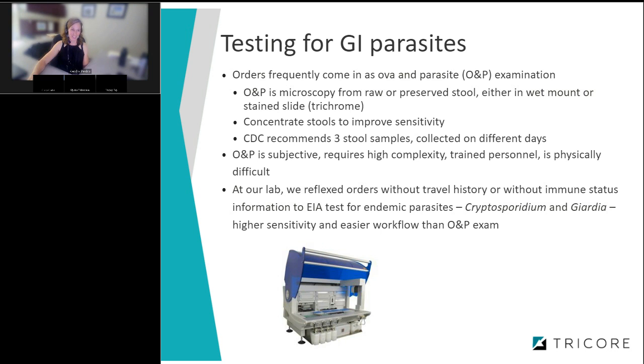Unfortunately, we automated that process using the DSX, and it had some issues in terms of pipetting stool samples. So anyone that's worked with stool samples knows that they're very heterogeneous. There tend to be chunks, and so when you're relying on an instrument to pipette from the stool sample, it can be very difficult.